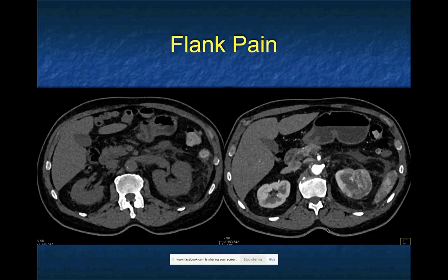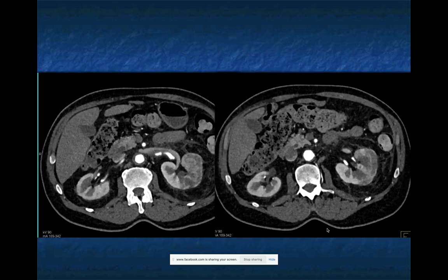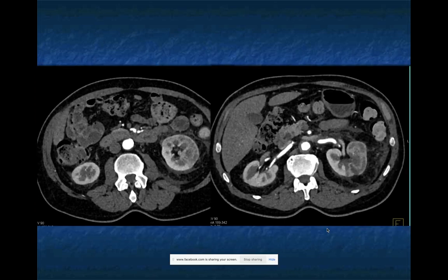Here's the first case: flank pain. You notice there's decreased attenuation in the patient's left kidney and stranding around the left kidney. As we go through a series of images, you can see the decreased attenuation in portions of the left kidney, with stranding around it. The patient's renal vein and artery both look good. So what are you thinking? You're seeing decreased perfusion, and you're thinking perhaps infection or inflammation - one of the two possibilities.